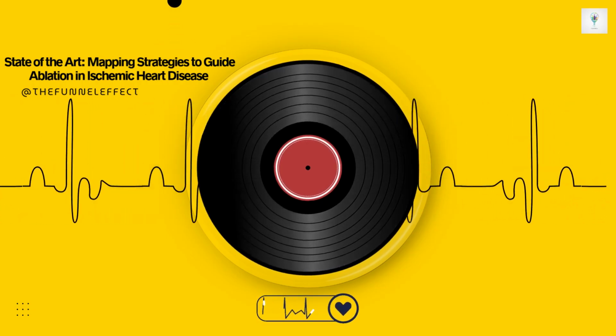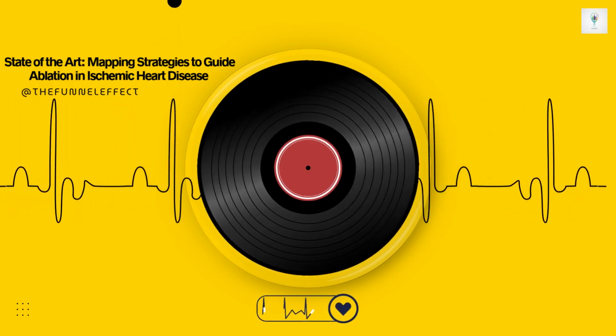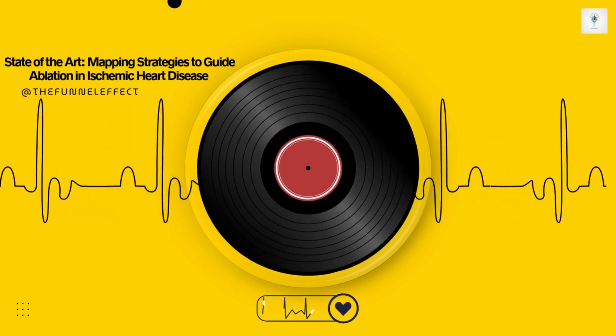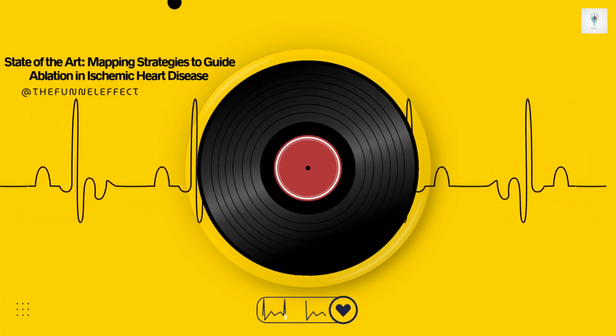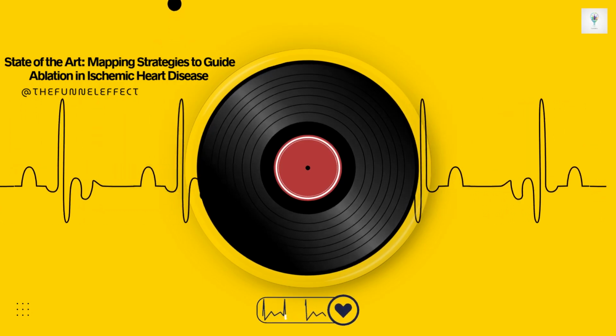One study showed that even after extensive endocardial ablation, if VT was still inducible, adding epicardial ablation significantly improved outcomes further. It really underscores that for big scars, you often need to tackle the substrate from both inside and out to be truly comprehensive and address that 3D structure.